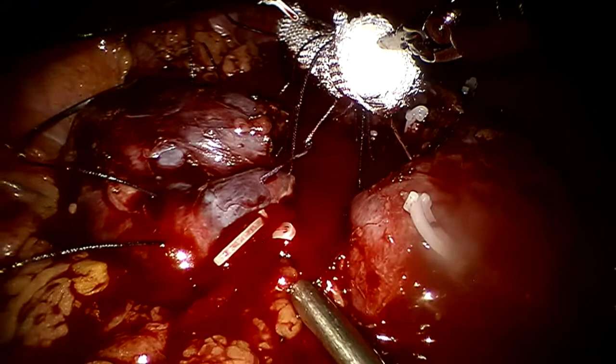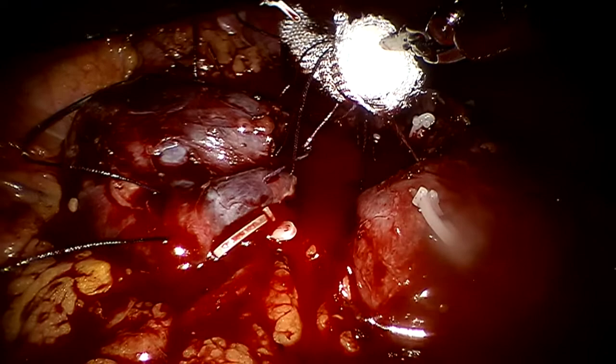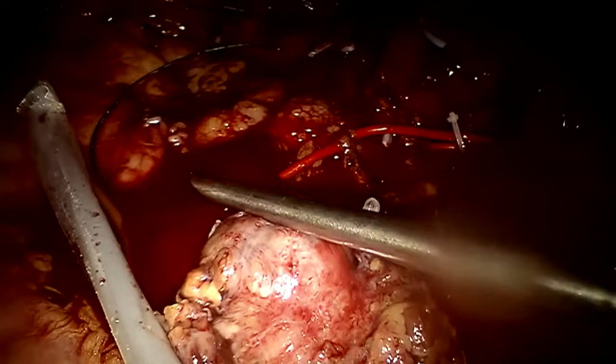Nice procedure. Very excellent. This section was fantastic. I think that you made the maximum in this case, and it's acceptable also to have a little bit of kidney not preserved, is normal. And I agree with you with the possibility to do a partial in this case in which you have an incidental thrombus in the vein. We demonstrated that when we published it in the AUA abstract, initial multi-institutional experience in which we demonstrated that the oncological outcomes are similar to a radical nephrectomy. That was a very nice paper from your side, so complimenti.